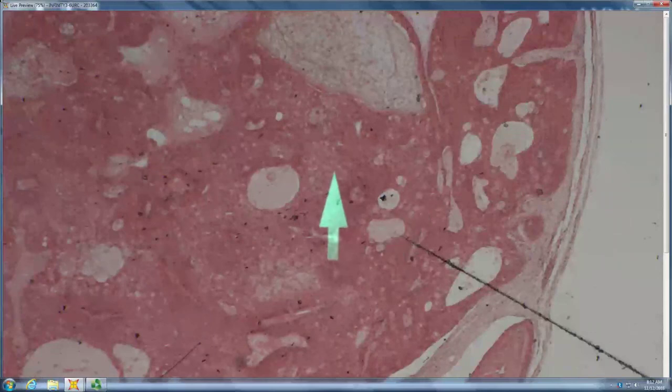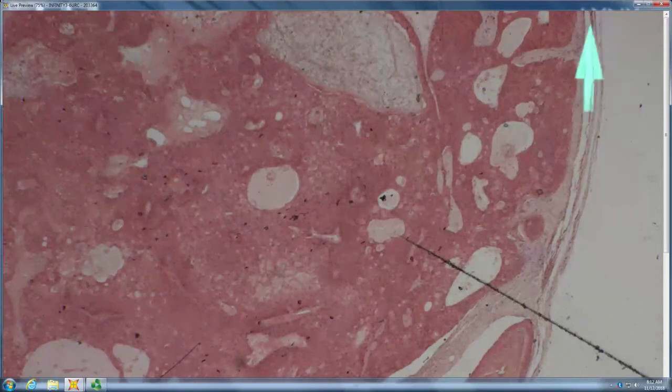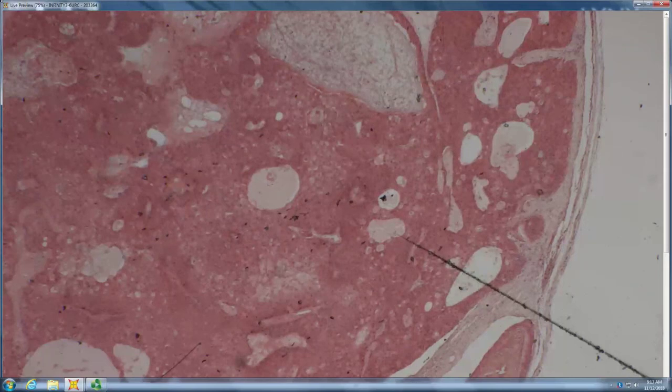Like a dermal duct tumor. Yeah, or big hidradenoma, right? Something in the acrospiroma group. But what if that's just where you have keratinization, because you see kind of keratinized cells in the middle? And so this is kind of a rolls and scrolls type complex nodule. Okay, well, no, it's not telling me trauma, but the pilar, yeah, pilar. Yeah, proliferating pilar. Very good.